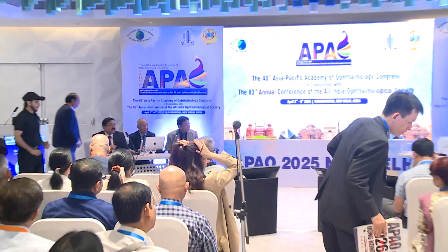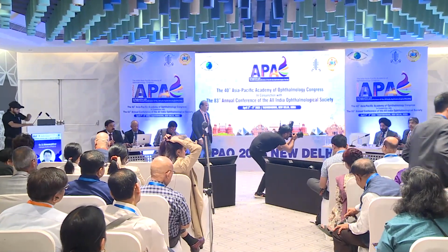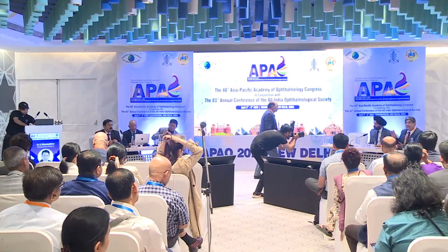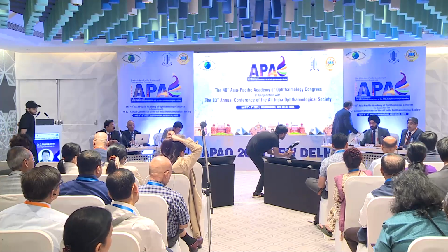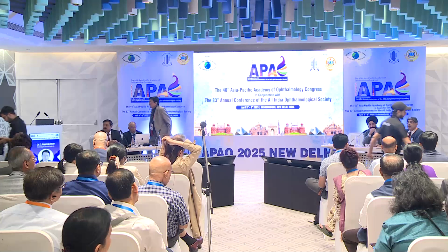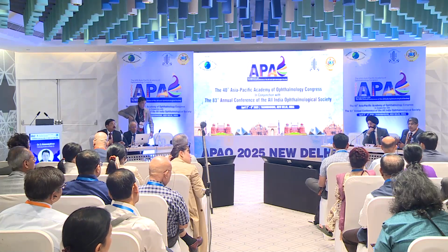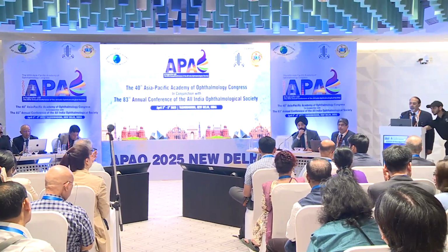One important thing is that we should not constrict the pupil intraoperatively at the end of the procedure, because earlier it was thought that we should constrict the pupil near the end. That should be avoided, because that will not release the viscoelastic from behind the lens. If the pupil remains dilated, the viscoelastic which is present behind the lens will come and mix with the aqueous, and it will not lead to the rise in intraocular pressure and the development of the cataract.